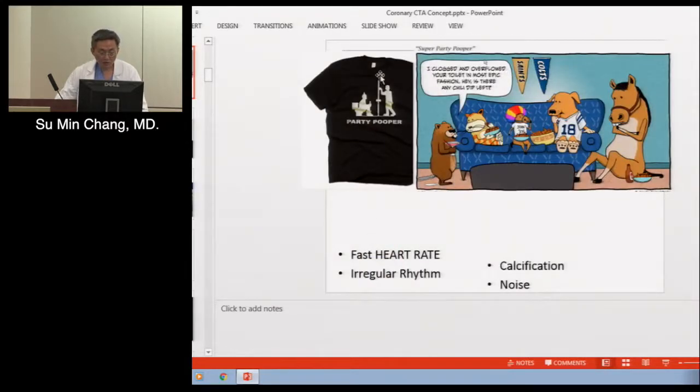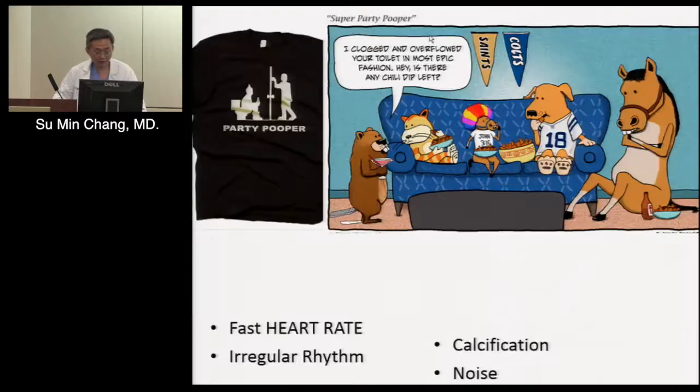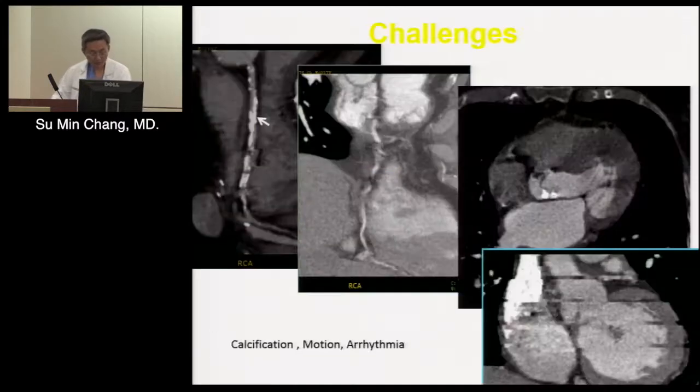So not every patient, every study we do is so beautiful, all right? So let's get to the dirty and ugly ones. With the new scanner, I think our new fellows are lucky. They're learning the CT, but with the older fellow, let's say Josh, who has been here for a while, I think it's not uncommon, unfortunately, to see images like this with our scanner.